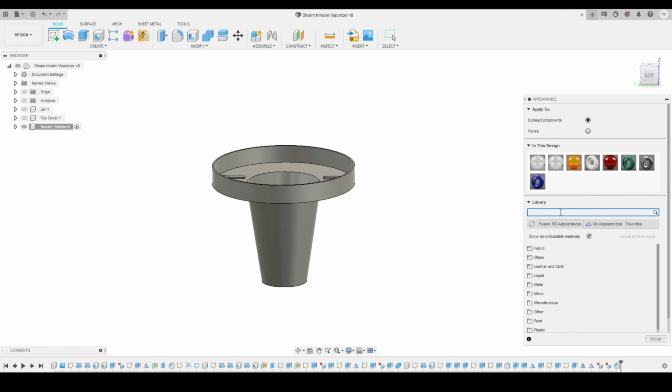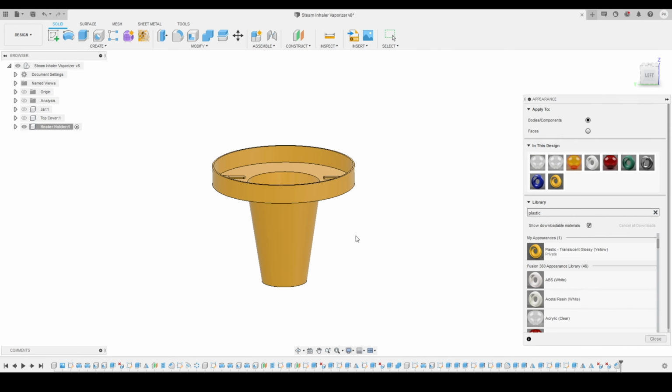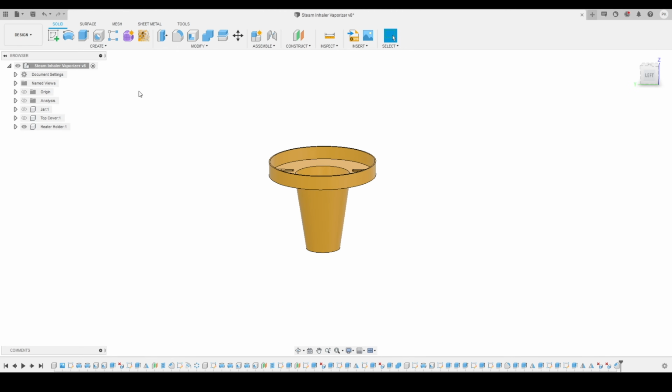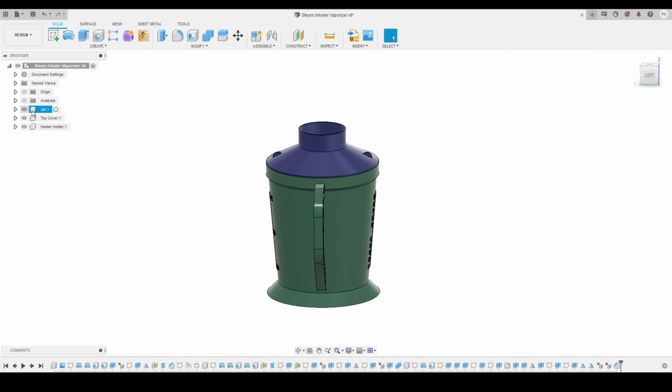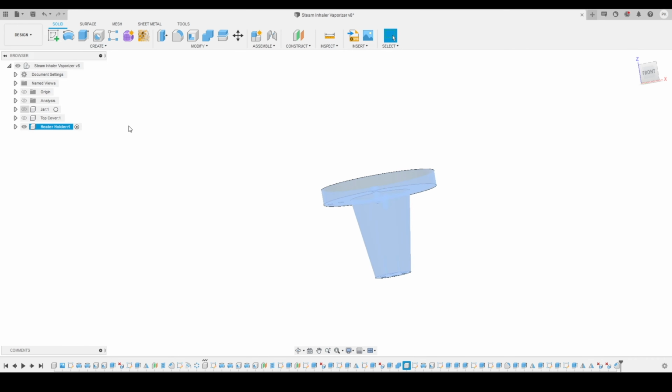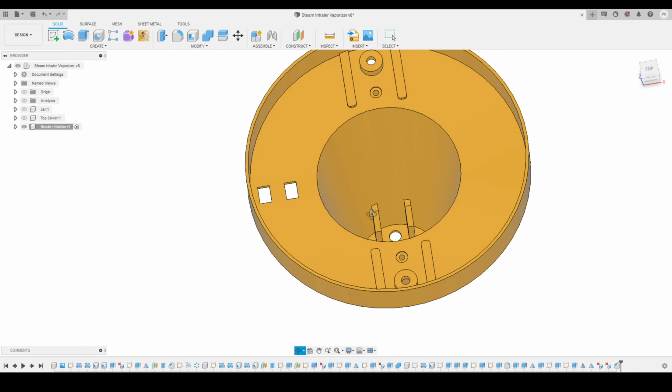So I will just search for some good plastic appearance, and here you can see I got all the plastics, and I will apply this yellow plastic appearance, and now it is looking very nice. If I turn on the top cover and all the components, I will be able to see it. If I turn on all the components, here you can see we forgot to add one feature on the heater holder. So we'll turn off the top cover and the jar, and here you can see only the heater holder is active.